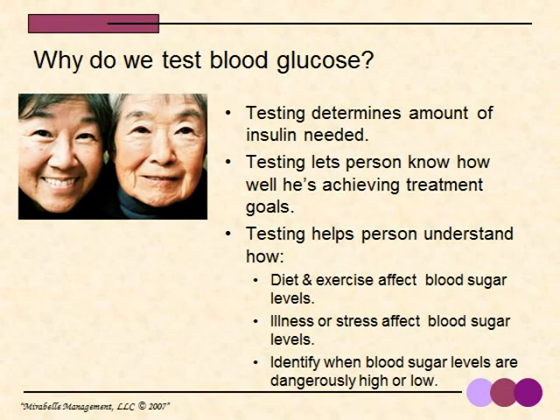Healthy bodies self-regulate the balance between sugar and insulin. Diabetic bodies do not. Without producing much or any of their own insulin, how would a diabetic know how much insulin to take to balance his blood sugars? That's why we test the blood, to know how much sugar is floating around and how much insulin will be needed to keep those sugars in a more normal range.